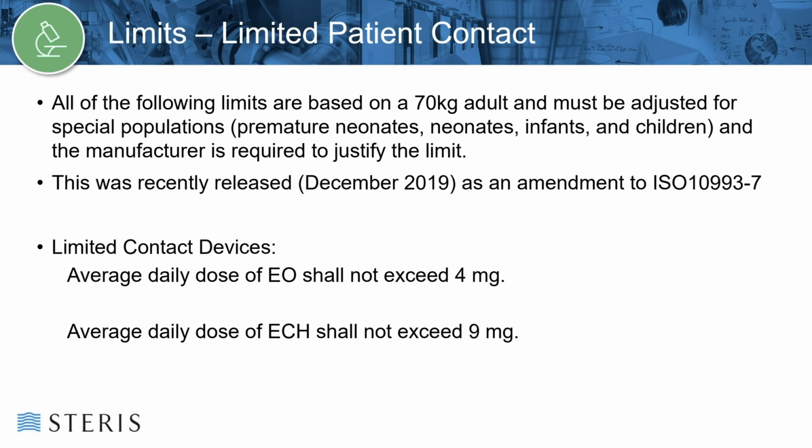Extraction parameters are based on worst-case patient contact for time and, in some cases, temperature. For instance, if the medical procedure for the device normally has a 1 hour patient contact, but could in worst-case conditions take up to 3 hours, the device would need to be extracted at 3 hours.